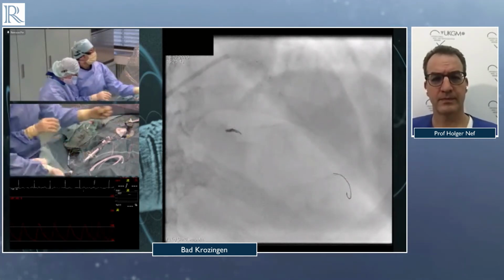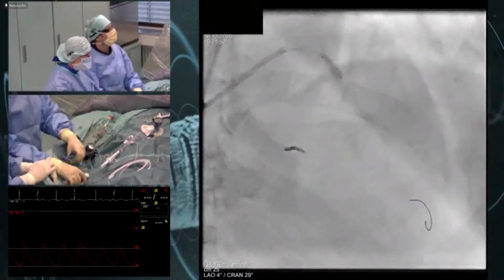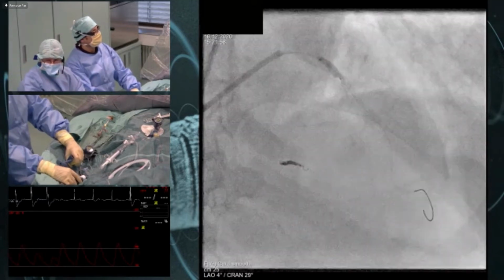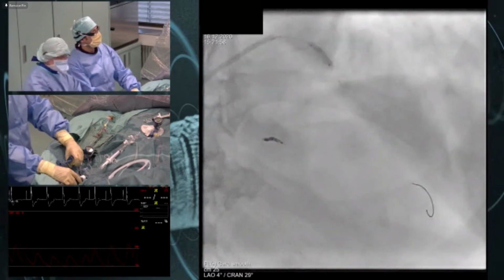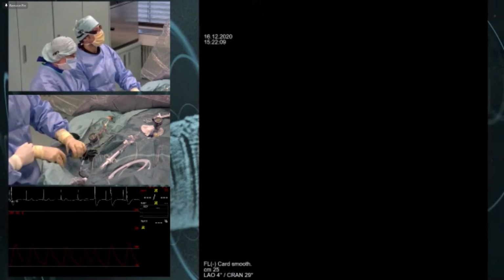Twice per segment. So we go now a second time for the same balloon position, and we will still have 5 shots more. It's 10 seconds, go to 6. And that's it.